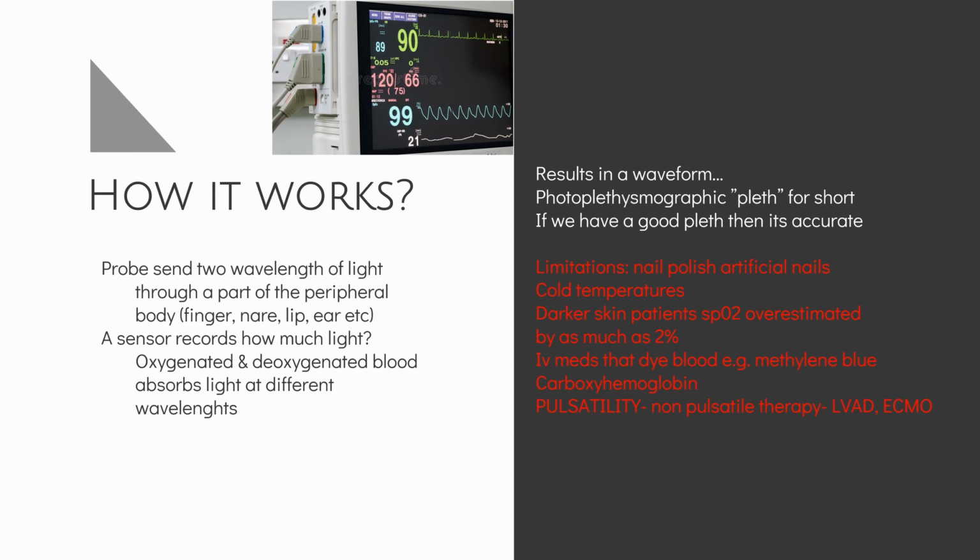And this waveform has a terrible name. We use the word pleth for short. The full name, which I'm probably going to mispronounce, is photoplethysmographic. Thank goodness we say pleth for short. If we have a good pleth, then the saturation is accurate. So if you're seeing a nice pulsatile wave, we can bet the saturation's accurate. But if the patient is fiddling or there's bad perfusion to the limb, the saturation won't be as accurate.